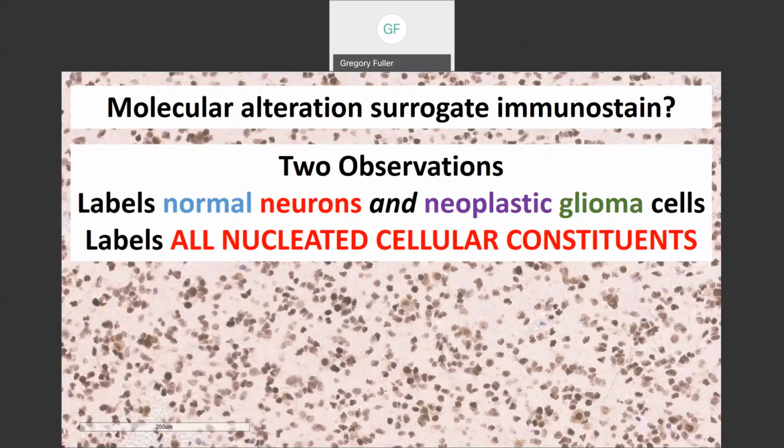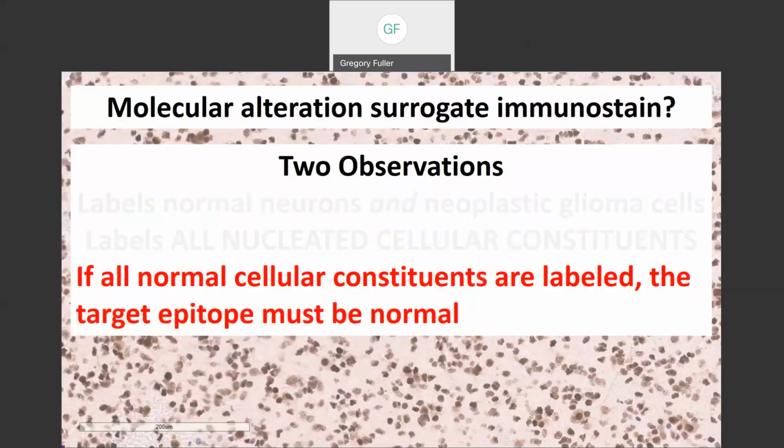All right. In humans, I know that's specious of me. In humans and other mammals, they are nucleated, and they would label in that instance. Which is a mental note: have a slide of ATRX canine in the future. Okay. So noted. Let's keep going.